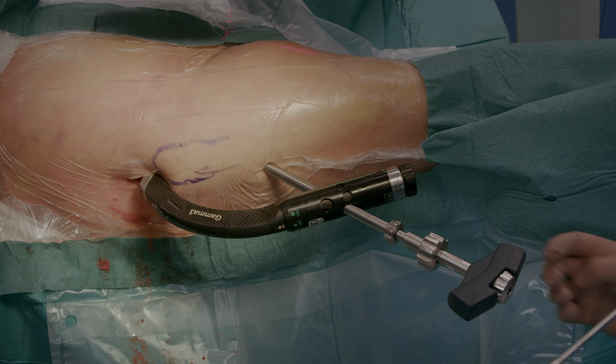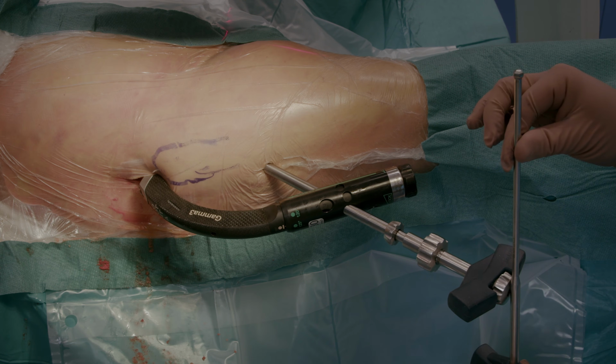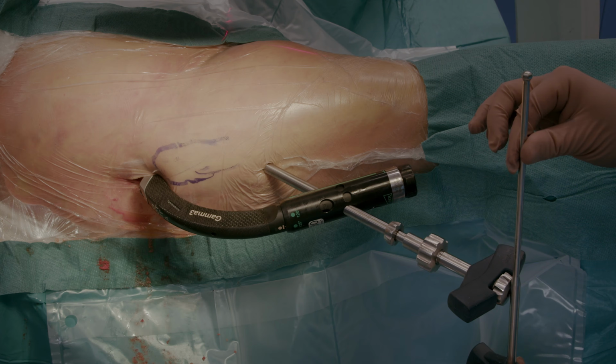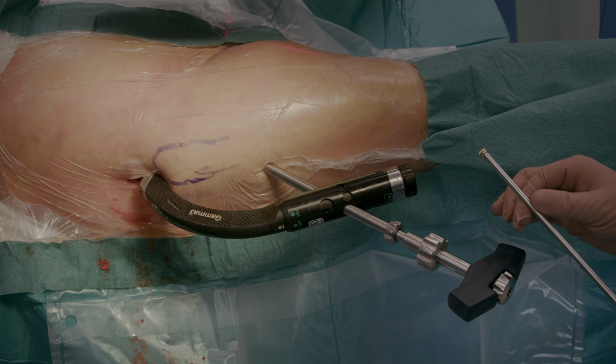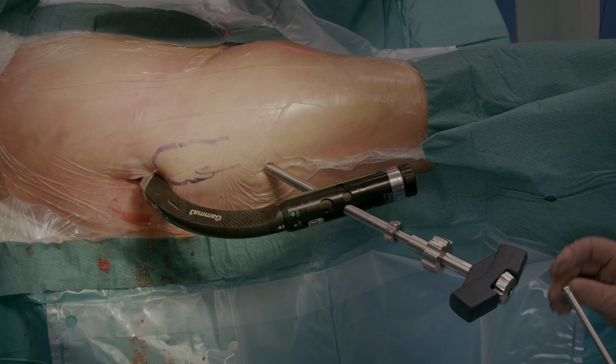As mentioned before, we should check that this handle is parallel to or at 90 degrees to the target device and at the same time with the diaphysis, so that the groove on this lag screw is now upwards. Next, I will lock the screw so that it will allow sliding but prevent rotation.